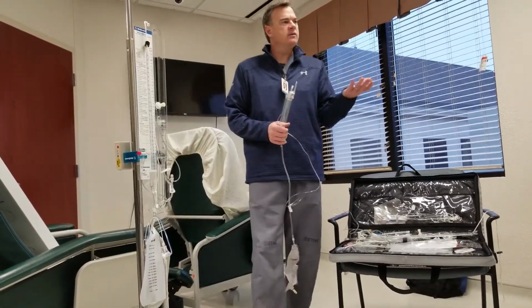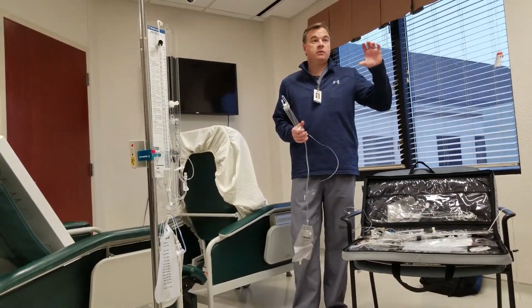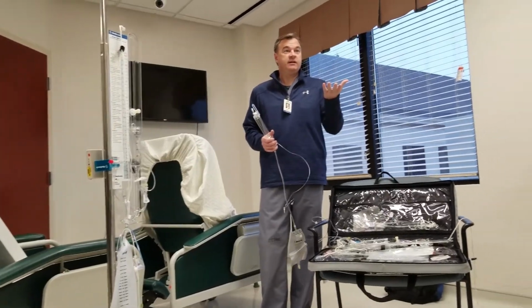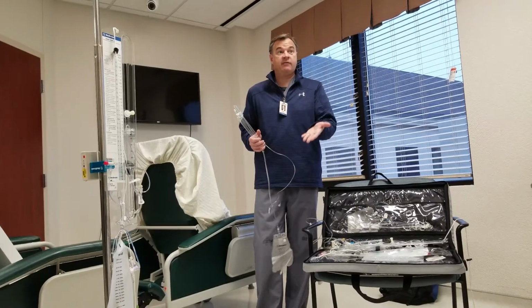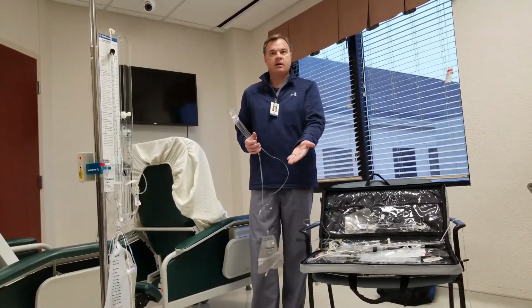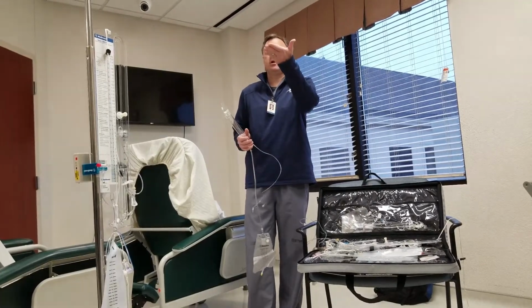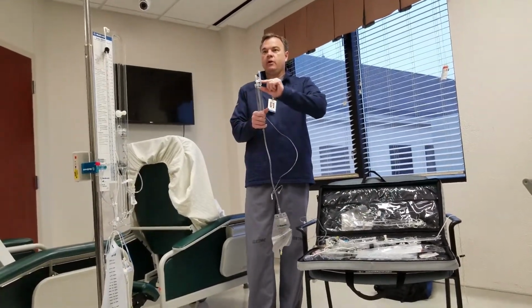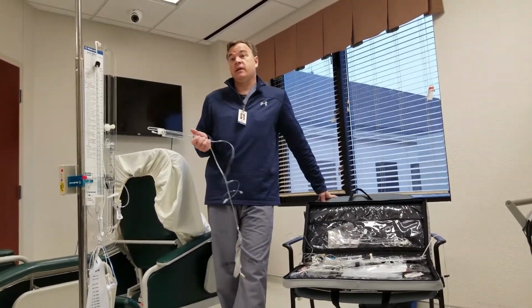I was telling somebody about it, it's not our product, but I think it's a great product. There's a Limitor. I think it's a great product because it's set it and forget it. It's got an automatic shut-off flow valve, almost like the back of a toilet float, where it just shuts off once the float gets to a certain level. If you're going to manage volume, that's a great product.